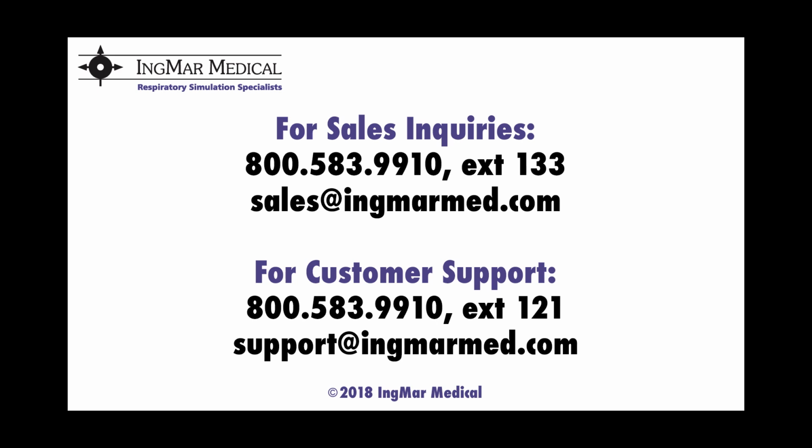So that leads us very nicely to our next question here from Robbie. Robbie asks, why is the red light a switch to begin with rather than just an indicator light? The red light is a switch and not an LED like the other LEDs on the front of the ASL 5000 for two purposes. The red light does a dual purpose. Once the red light is depressed and the red light goes off, that is the indicator that it is ready to accept the software, the ASL 5000 software from your computer.